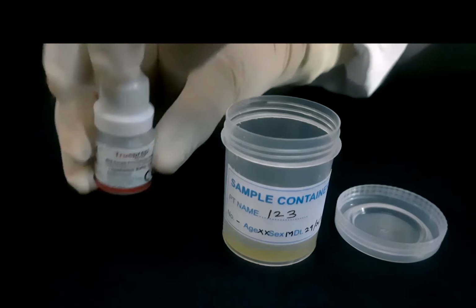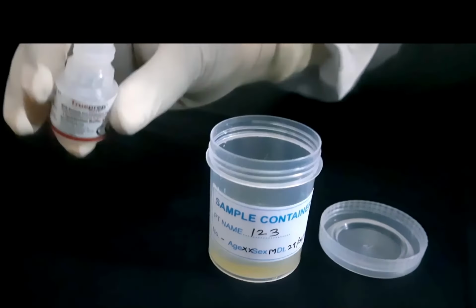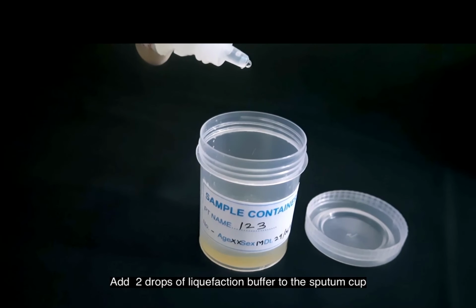First thing first, you have to liquefy this particular sample. You have to put 2 drops of this liquefaction buffer. Please be careful, as I told you, for the entire kit only 1 bottle comes, so use it as per the SOP. So first, 2 drops.